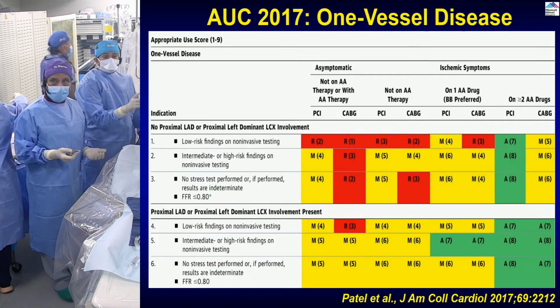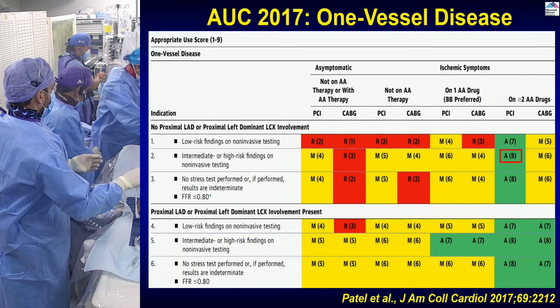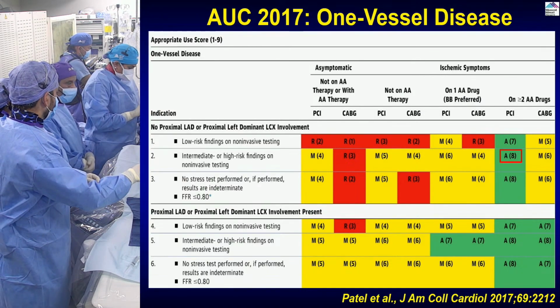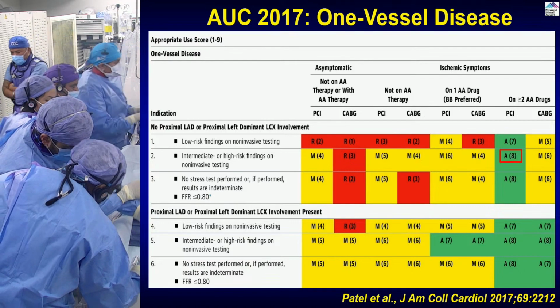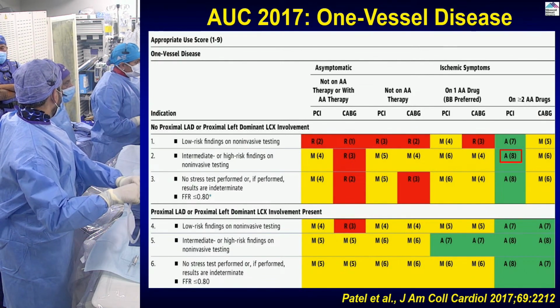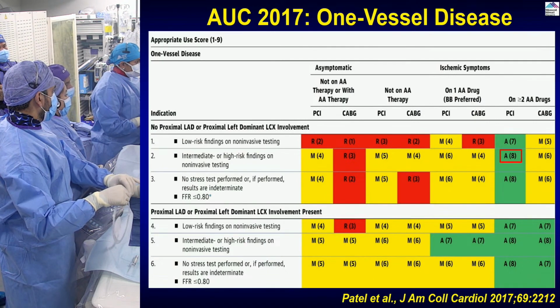And this is by definition appropriate because, although there is no proximal LAD disease, the patient is on double anti-ischemic therapy and has a positive stress test. So the appropriateness is a point that could be very well debated, and I have no question on that. This kind of complex lesion, where there is a high chance of complication, it's okay to manage medically, but the issue here is that the anesthetist will not do the surgery because of the ischemia. Because ejection fraction is good, you clear it, it's fine. If EF is less than 30%, then they will definitely ask for some kind of assessment.